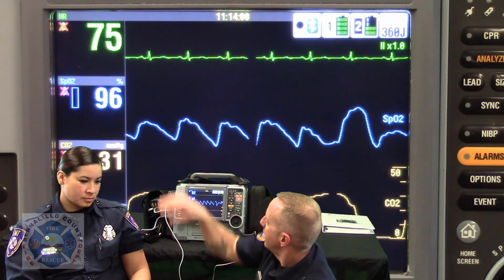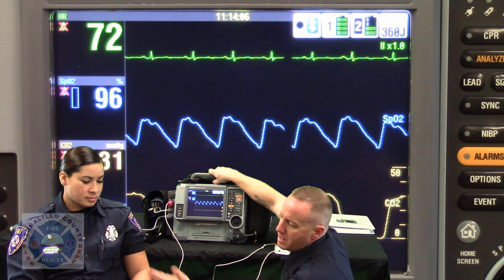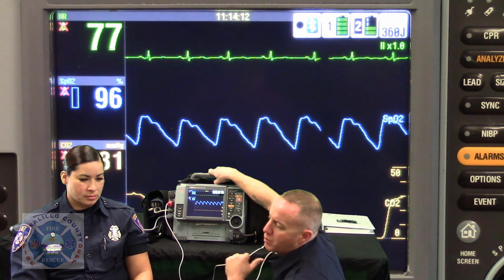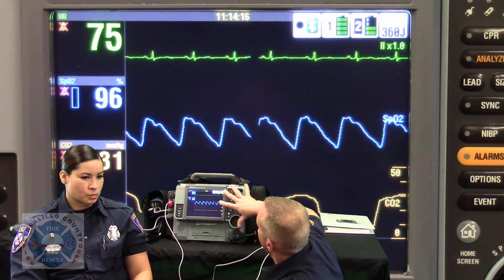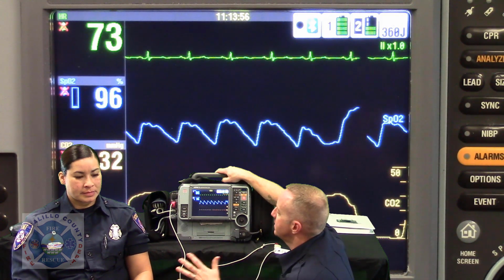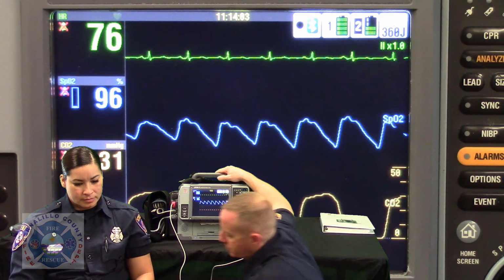Now, again, set my monitor to the patient's left side, giving me the left side when appropriate to do all of my assessments, and freeing up the right side for IVs or any other invasive blood sugar checks or temperature. We're not going to be fumbling over each other, and the cables are not draped across the screen and printer to reach the patient. So just by making these very quick, easy setup steps, you can see that a lot is done, and the assessment is going along swimmingly.